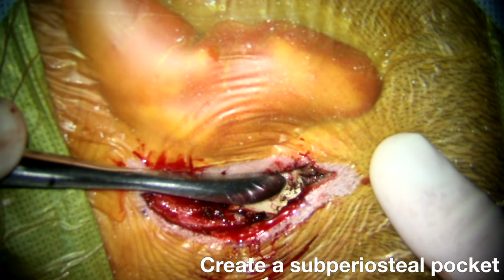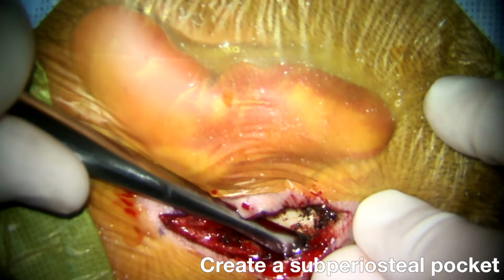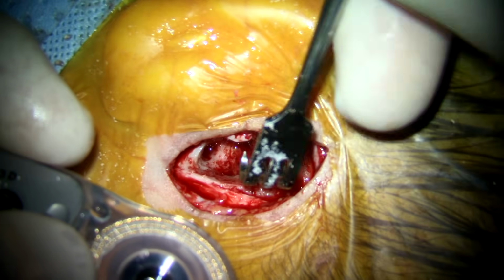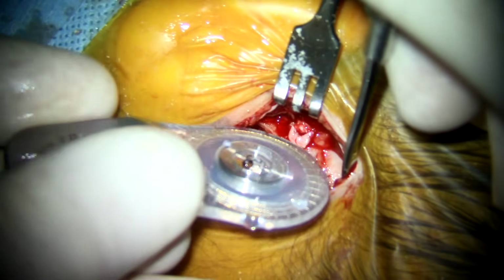So here we're using a Cobb elevator to get underneath the temporalis muscle between the squamosal, parietomastoid, and lambdoid sutures. Avoid too much elevation to keep your implant snug.